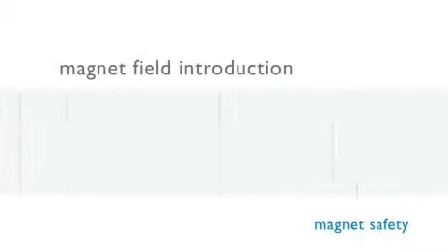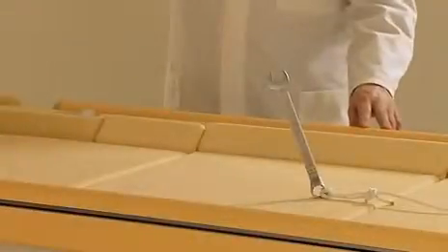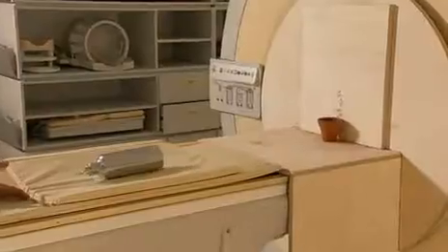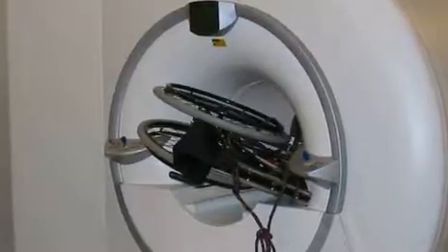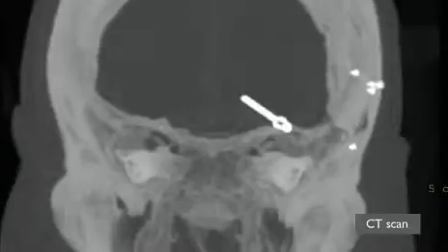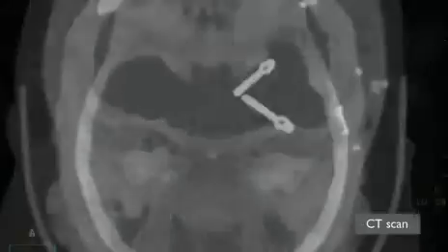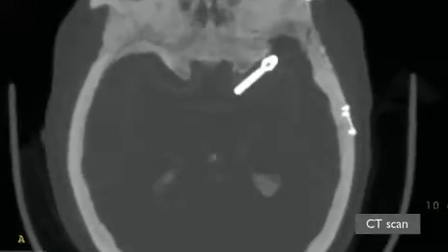Magnet Field Introduction. The magnetic field will attract objects made of steel or other ferromagnetic materials with enormous force. Even heavy objects can fly into the magnet. The magnetic field can also create torque forces on ferromagnetic objects, such as some implants, which may cause tissue damage.